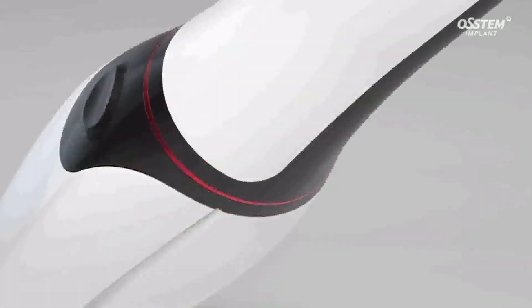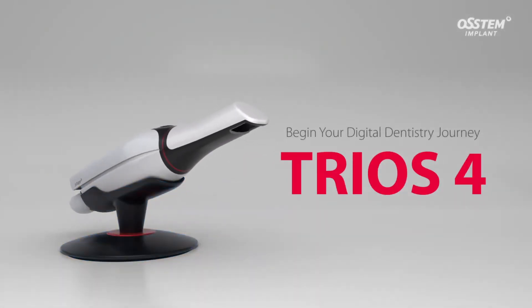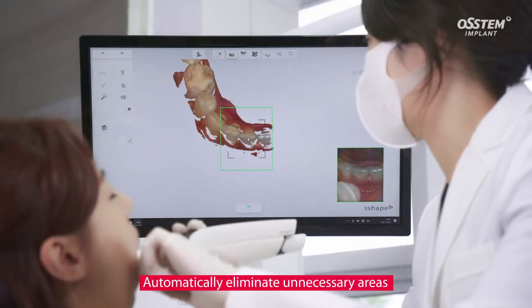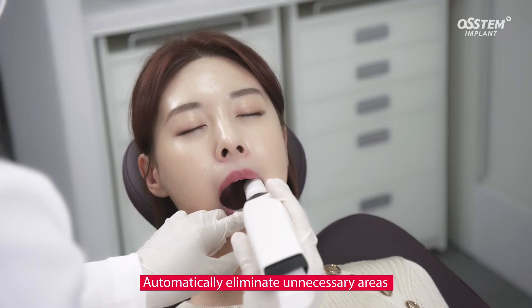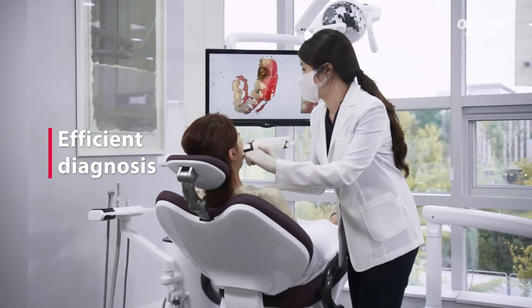Introducing the TRIOS 4, an intraoral scanner which scans and digitally replicates the oral cavity in three dimensions. The TRIOS 4 is extremely precise and offers fast scanning. It automatically eliminates unnecessary areas such as lips and cheeks during scanning using the AI scanning function, so even novice users can scan quickly and easily.